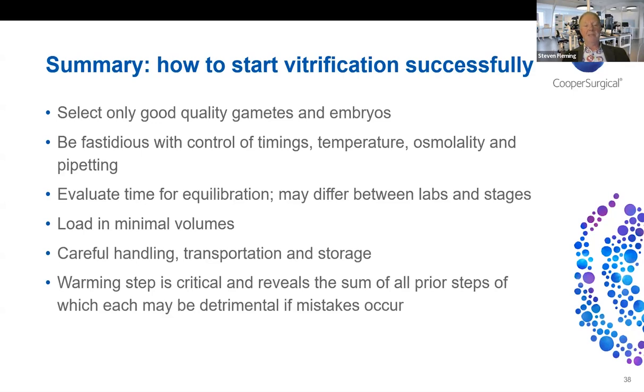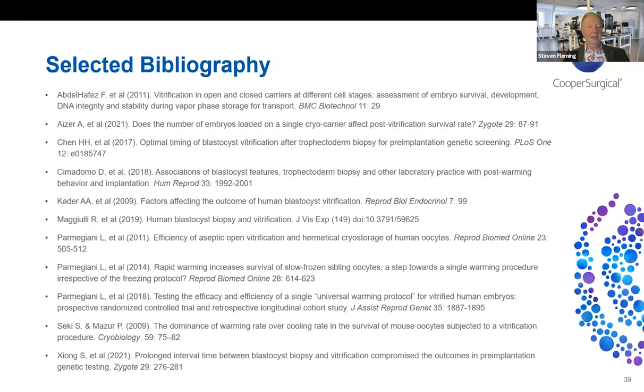Be really careful about how you handle the carriers, especially if you're going to transport them between labs, and especially if you're going to do audits of your tanks. And as I think I showed you, the warming step is critical and reveals the sum of all prior steps, of which each may be detrimental if mistakes occur. Some selected bibliography there. If you need any of these publications, then don't be afraid to ask.